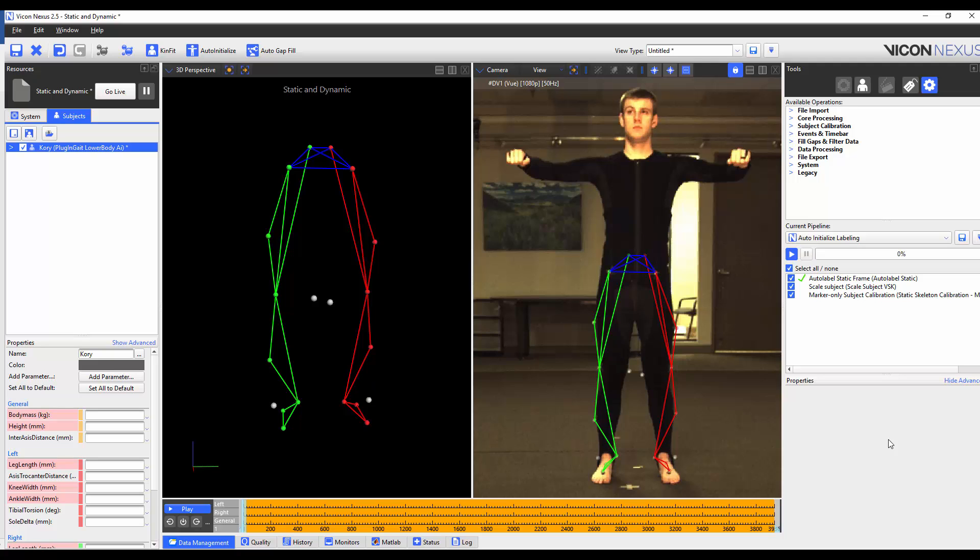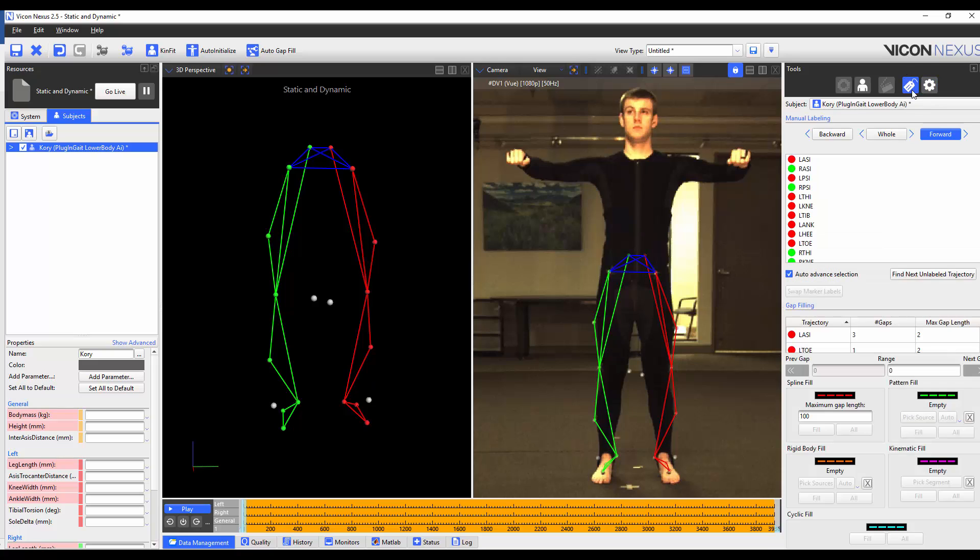To fix this I'm going to navigate to the tools pane label editor list and label the ankle markers correctly.